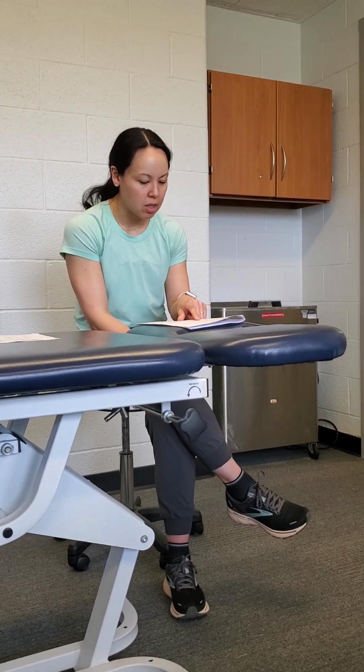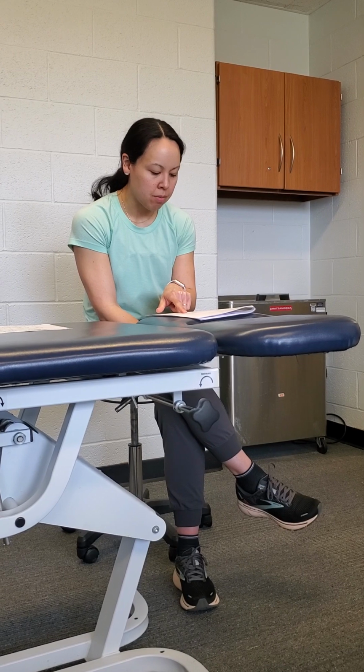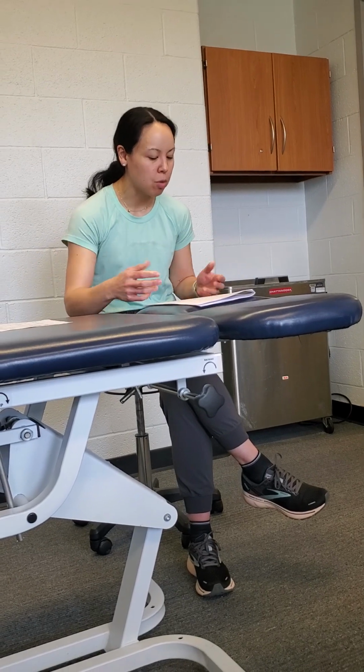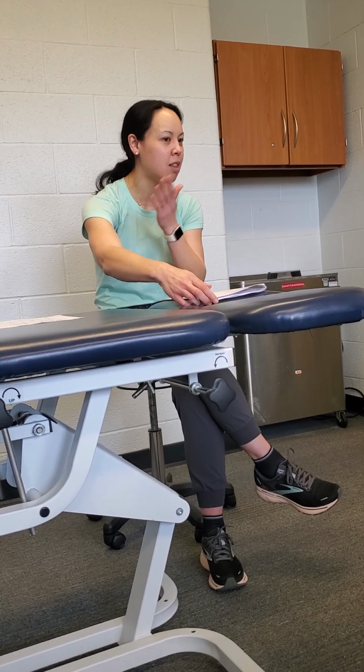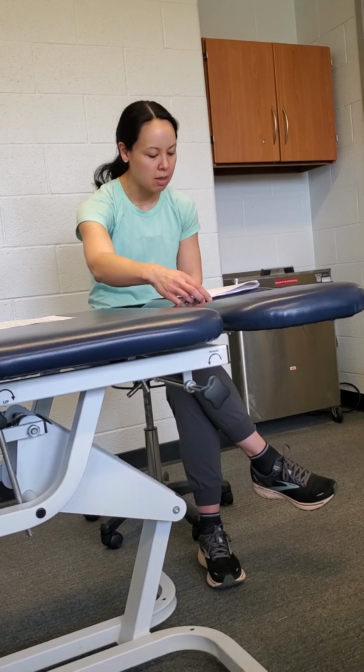These cuffs are obviously a lot wider, so they're a little more comfortable, but I remember doing the lab, and you guys will feel it today, it's not super comfortable. That's important to note to patients: it should be tolerable, but it's going to be uncomfortable probably until they get used to it. The first session is usually the hardest, and then patients know what to expect in subsequent sessions.